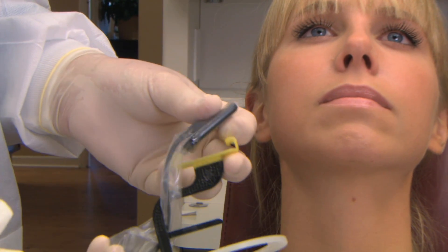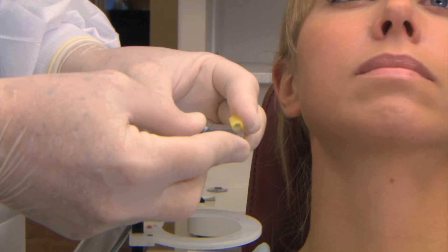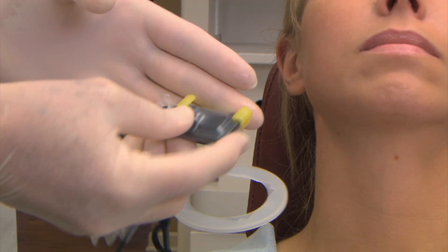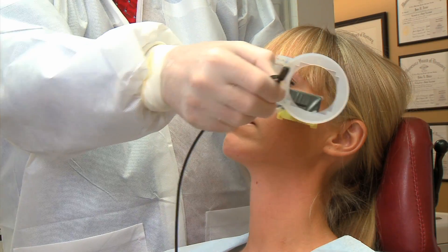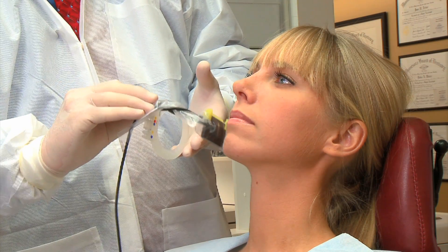Slide the sensor out and move it to the opposite side. Make sure the sensor is positioned about halfway in the claw. Change the ring to the opposite side. Then you can pick up your uppers and lowers.